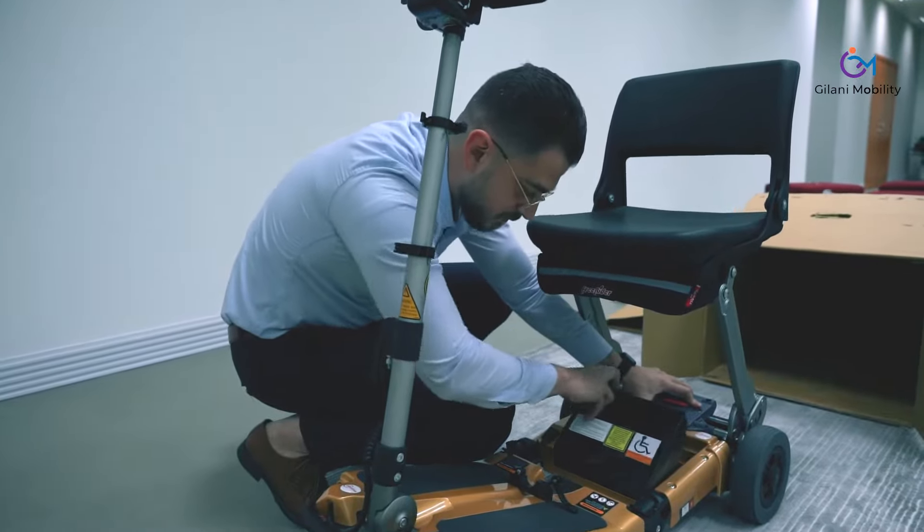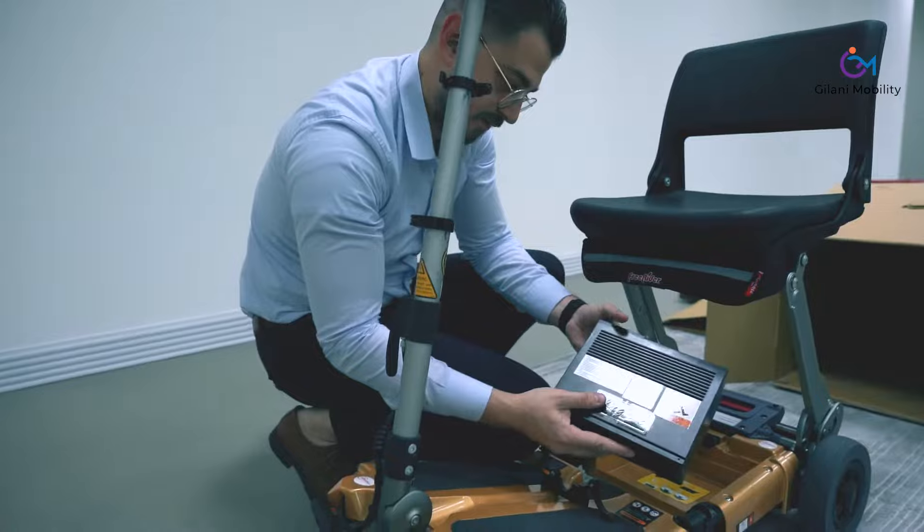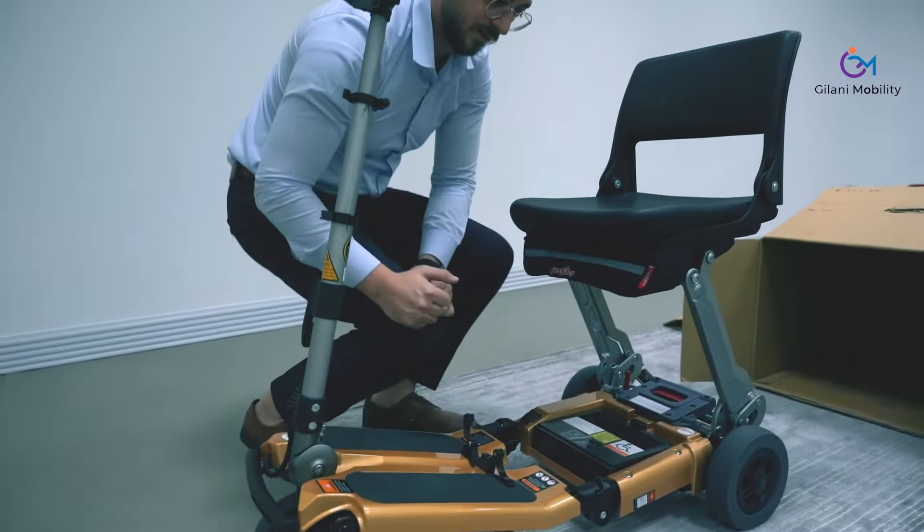The battery is a lithium iron 10 amp hour battery, which will get you going all day easily. It is simple to remove from under the seat.